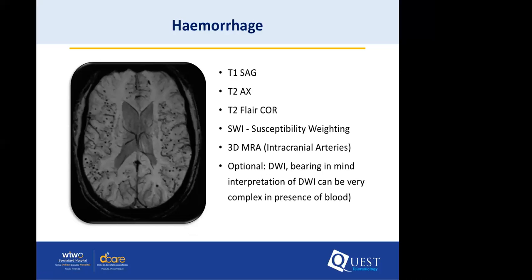If there is a question of hemorrhage in the clinical presentation that you'd have to rule out, stroke also has where you have to rule out hemorrhage, and there are a number of indications that would include that. When you're talking about that, always include a susceptibility weighted sequence. That is very important, where you have blooming artifacts that you see here, tiny microhemorrhages on the cortical gray-white matter interfaces. Very important. This is a patient with amyloidosis. So susceptibility imaging is a key image when you're talking about hemorrhage in a brain.